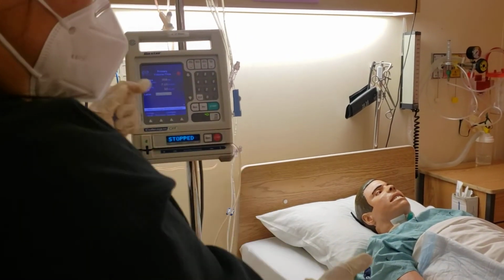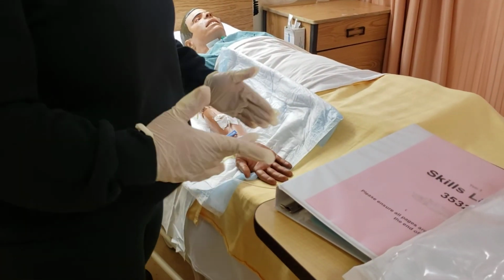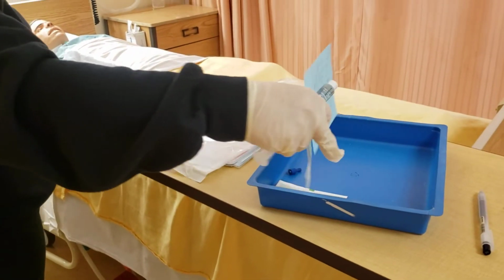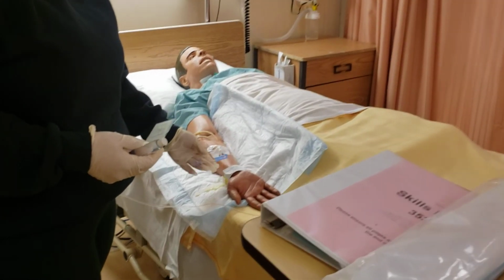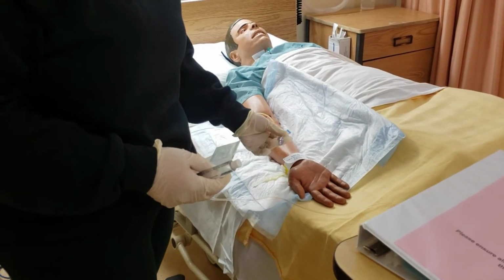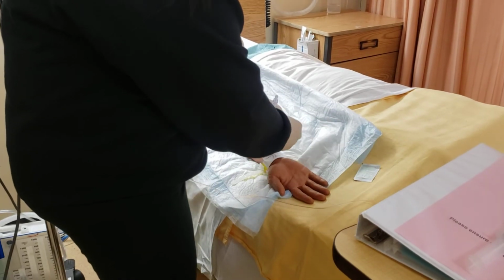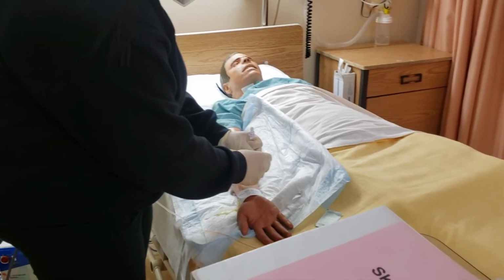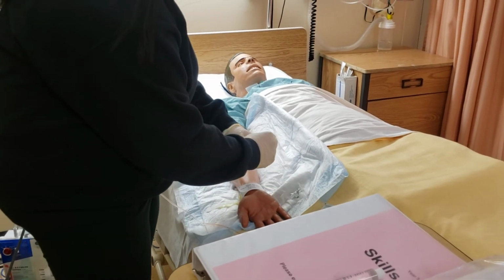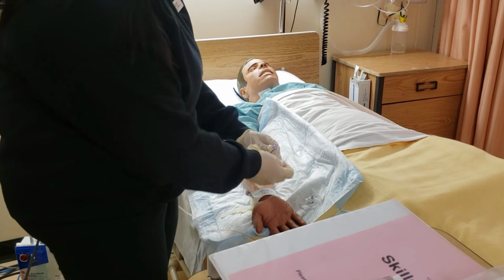Then we're going to check our patient's IV site. We want to assess our patient's IV, making sure there's no bleeding, redness, or swelling, and then we want to flush it to check its patency. I'll swab the port for 30 seconds and let it dry for 15.